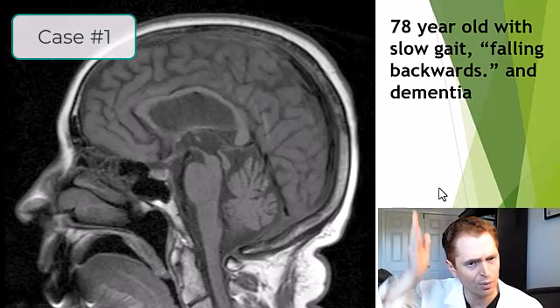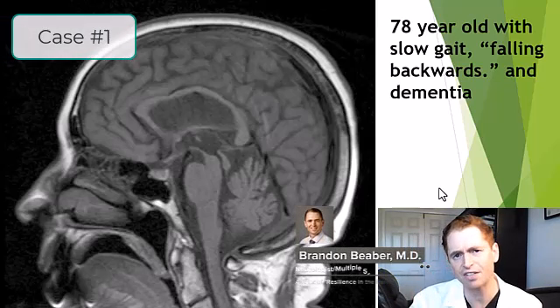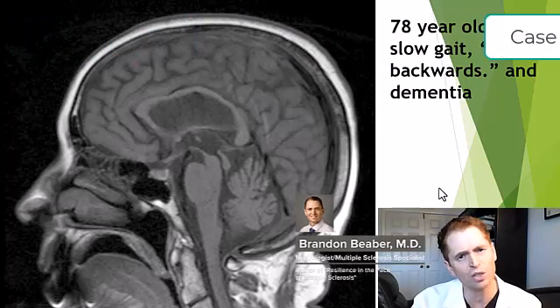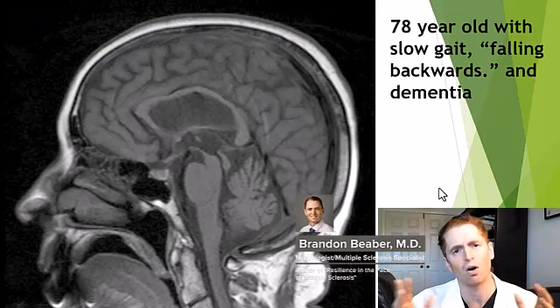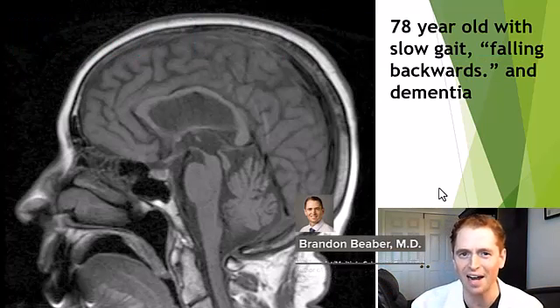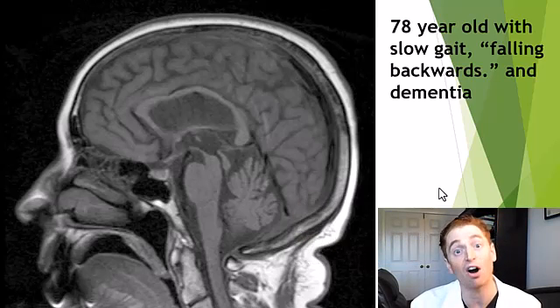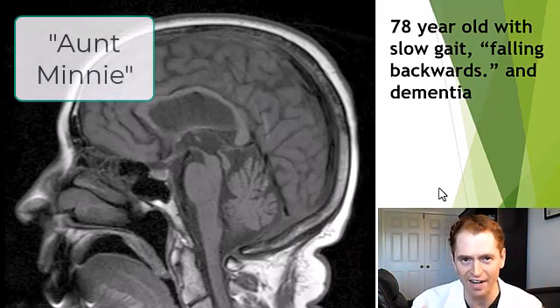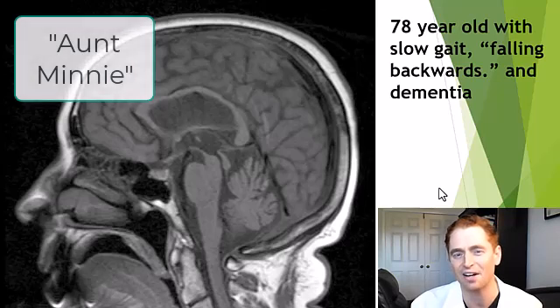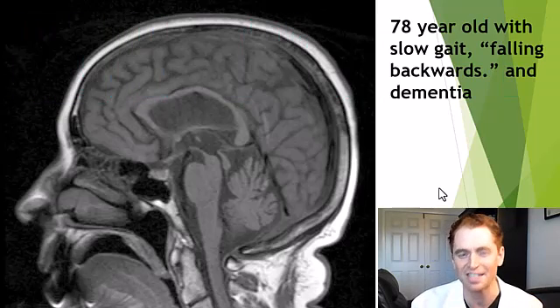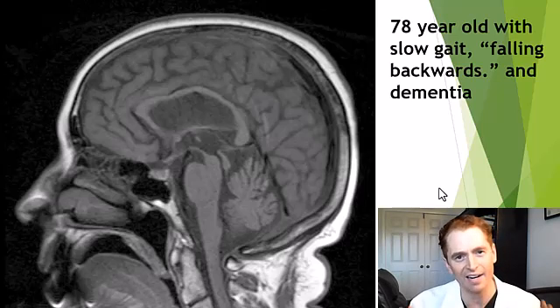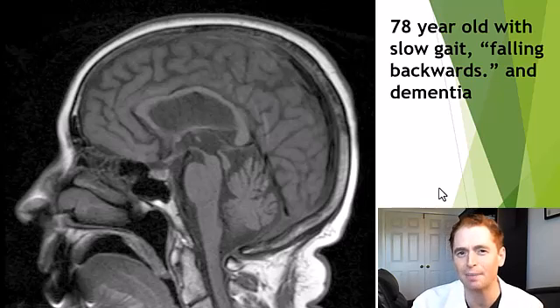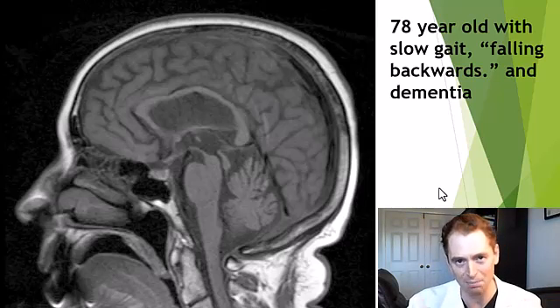This is a sagittal image of an MRI — we're looking at slices of a 78-year-old who is having difficulty walking, falling backwards, and also has dementia. Do you know the diagnosis? This is an example of an 'aunt mini,' a distinctive radiologic finding that makes the diagnosis immediately obvious. Can you pass this neuroradiology aunt mini quiz? I'm going to give the answers in the second half of the video. Feel free to pause at any time to look at the images — we're going to go rapid fire — and let me know how you did in the comments below.